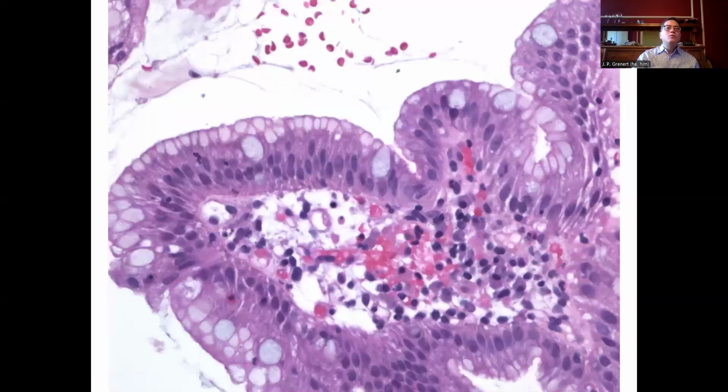And so this then would correlate with endoscopic findings. If you saw the salmon-colored mucosa, then this would fit with Barrett's esophagus. And so again here, these bluish, large mucin vacuoles, this is intestinal metaplasia. In this case, there's no cytologic dysplasia here. The nuclei are all still small, not very dark staining, very uniform from one to the next.